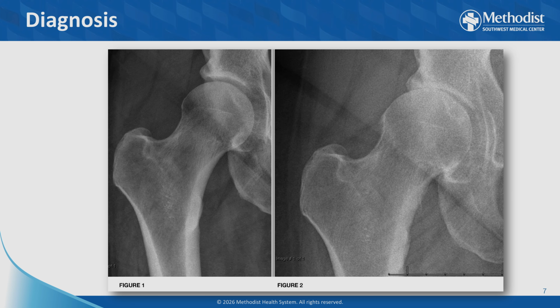As you can see here, there's a normal ball and socket joint on your left there, and there's a big space between the two bones, okay? When we take x-rays in clinic, I specifically take x-rays where people are putting weight on their legs, so they're weight-bearing x-rays, because it shows us what does your joint look like when you're normally walking. And this person on the right-hand side here, you can see there's no space left in that joint there.